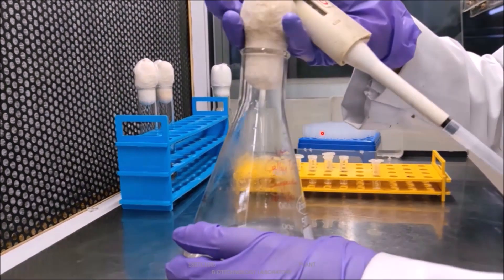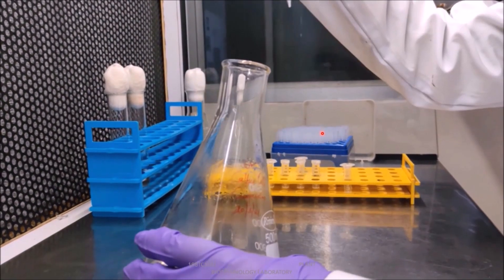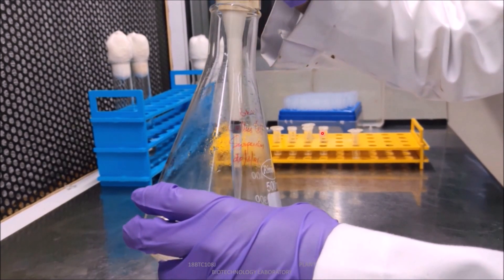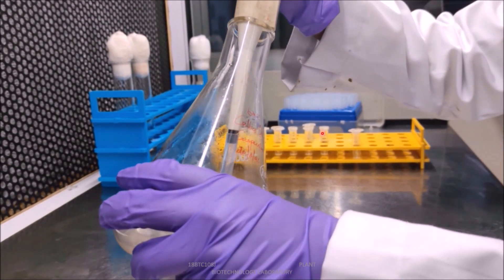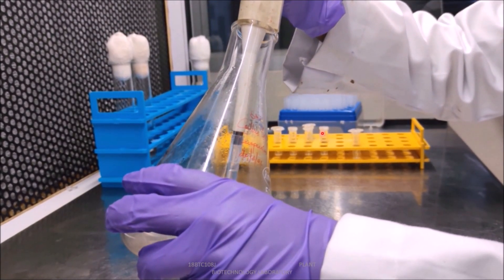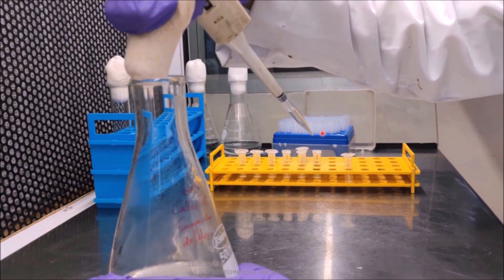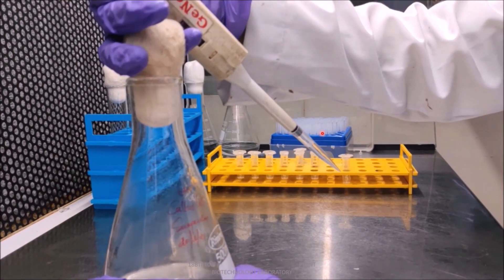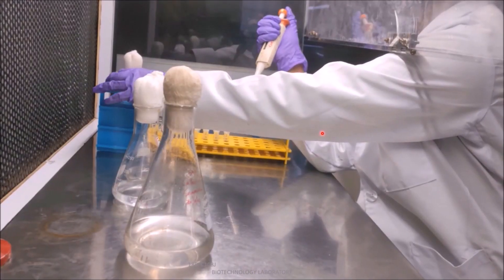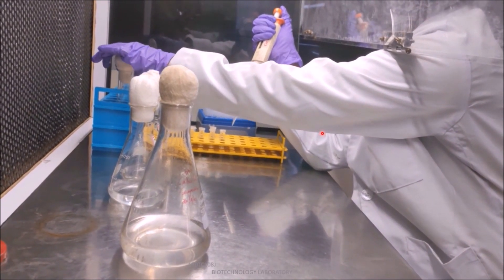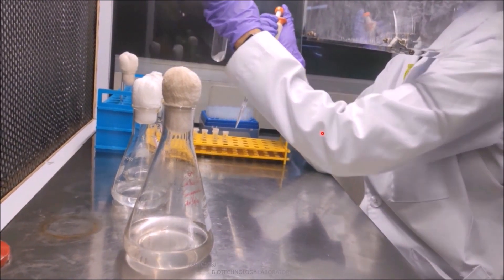Once the cell density and viability were determined, specific volume of cells were distributed into the fresh medium. Here, we have taken suspension culture aliquot volume of 30 ml into 70 ml of fresh liquid medium.